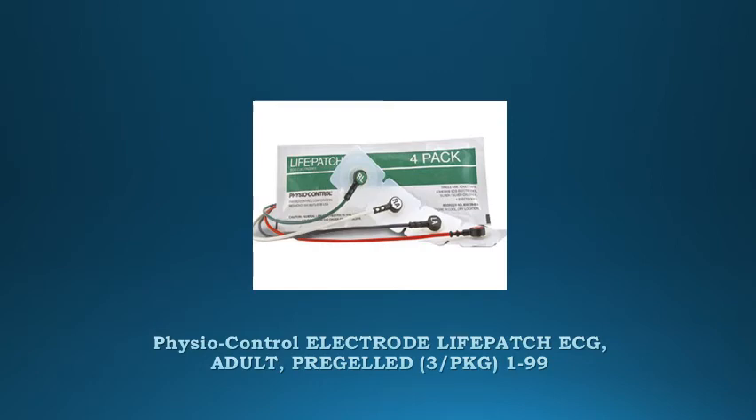Physio-Control Electrode Life Patch ECG Adult Pre-Gelled. Adult Pre-Gelled, package of 3 electrodes. For use with LifePak 12, LifePak 20, LifePak 1000, LifePak 20, LifePak 15.